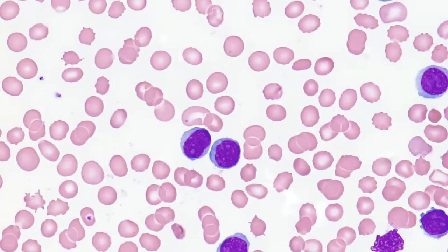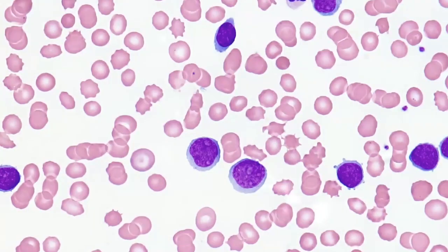identified. It's important when evaluating a case of CLL to keep your eyes open for any significant population of prolymphocytes. Prolymphocytes are characterized by a centrally placed round or ovoid nucleus, which may or may not be slightly indented, and typically show a single prominent nucleolus. Prolymphocytes also have a moderate amount of blue cytoplasm that often surrounds the entire nucleus, and rarely the cytoplasm may contain a few pink eosinophilic granules.